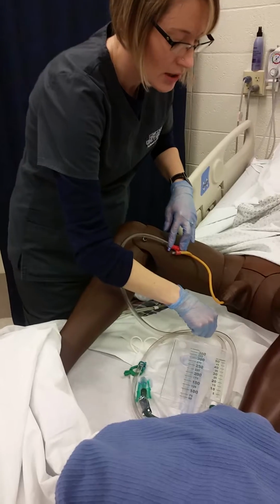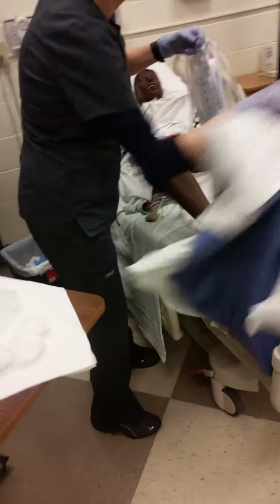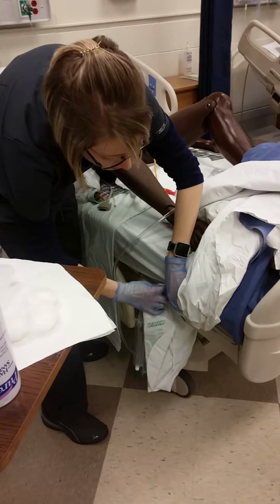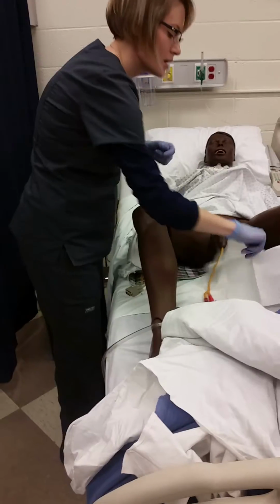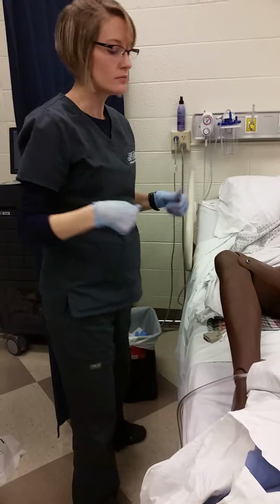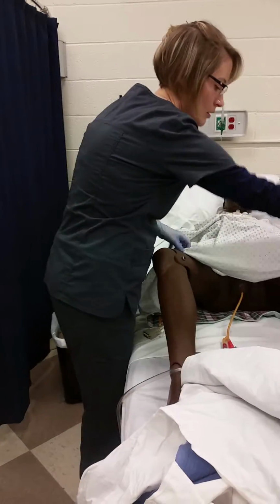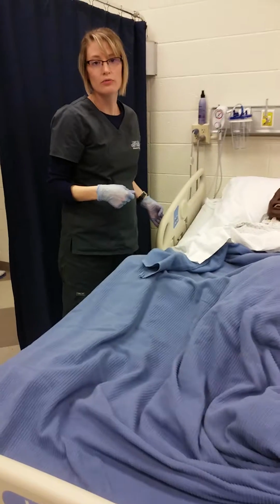And then once that is secured, I'm going to take this catheter bag and place this on an immovable part of the bed, making sure that there are no kinks in the tubing, that he has good urine flow down into the bag. I'll take his drape out and throw that away. And then I will cover him back up, and I'm going to lower his bed back down. Make sure that his call light's in reach.